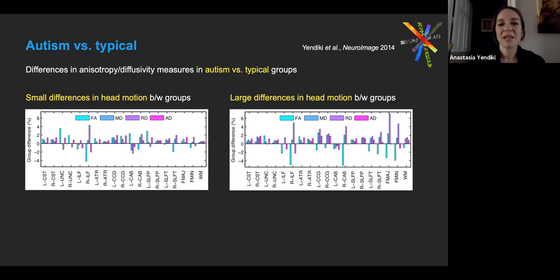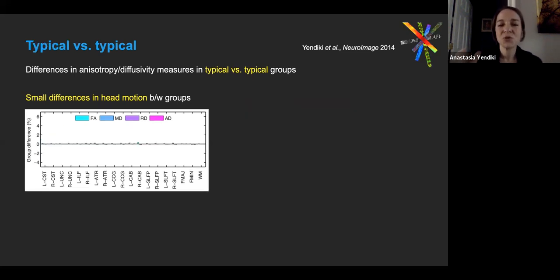One might ask, well, maybe there is something biologically different between these subjects with autism that move more. So how do you know that this is not a natural biological effect? Then we repeated this experiment, choosing randomly 30 and 30 subjects from the typical children, from the control group only. So this is only 30 controls versus 30 controls, and we're picking different sets of 30 every time.